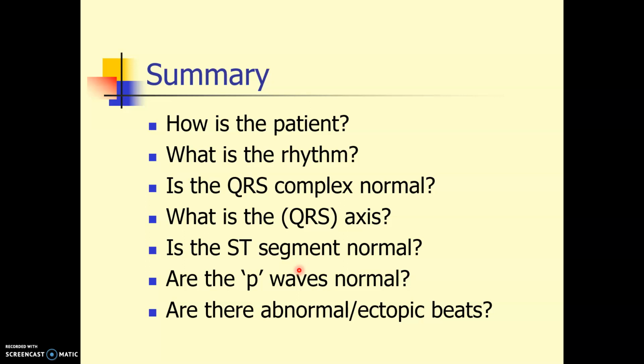Just to remind you of how we approach this: look at the patient, look at the rhythm, look at the QRS complex and axis, then the ST segment, and finally the P waves and any abnormal or ectopic beats. Our final lecture will be on cardiac rhythms.